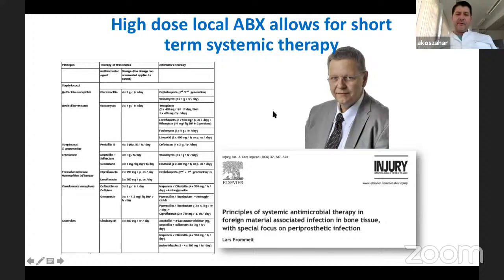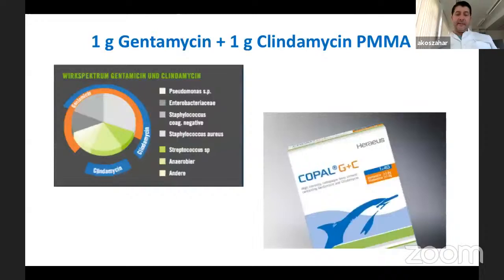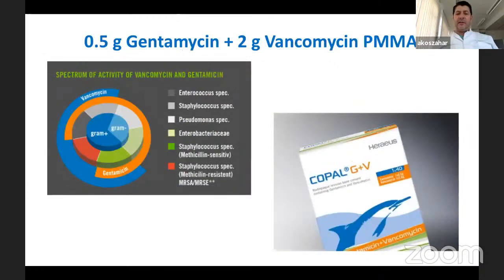We always discuss the antibiotics both locally and systemically with the microbiologist. This is Dr. Frommelt, I was working with him for many years in the endo clinic. The standard antibiotic loaded bone cement we are using is the Copal, which has two options, Copal G and C, where you have 1 gram of gentamicin and 1 gram of clindamycin. Or the other option is the G and V. You have 0.5 gentamicin and 2 grams of vancomycin.